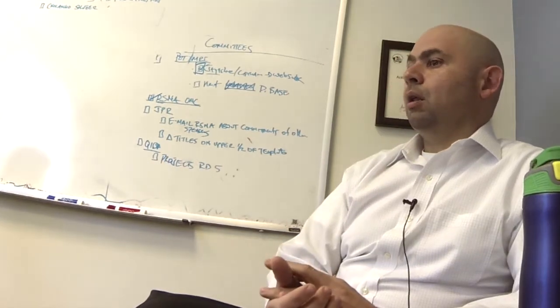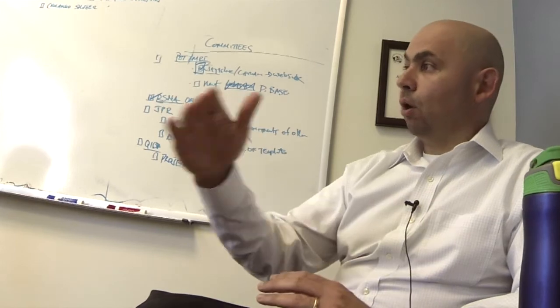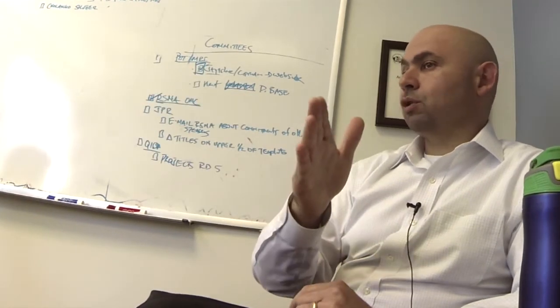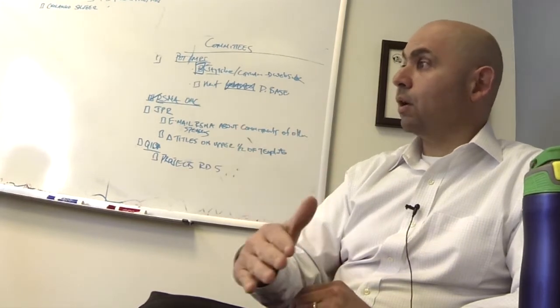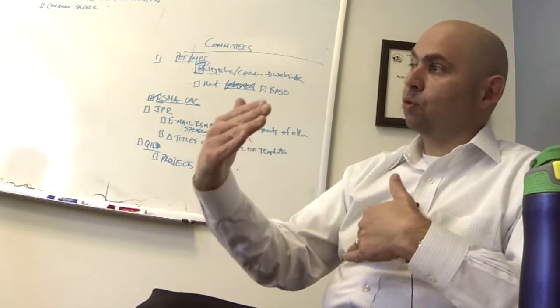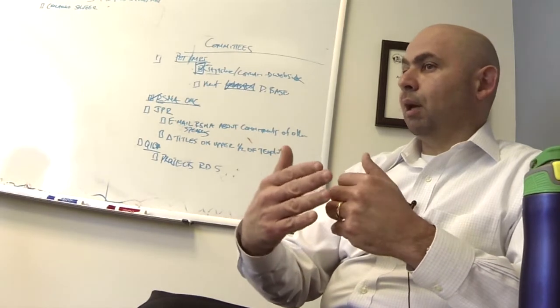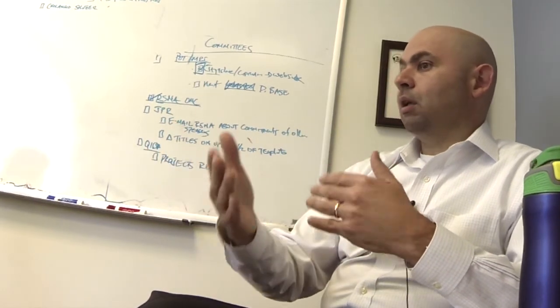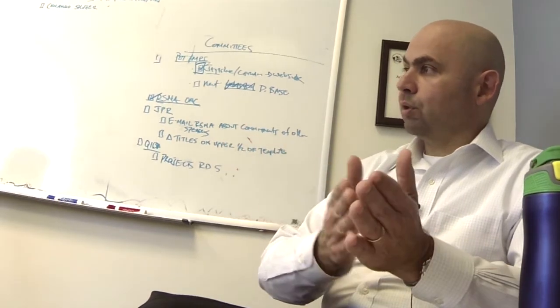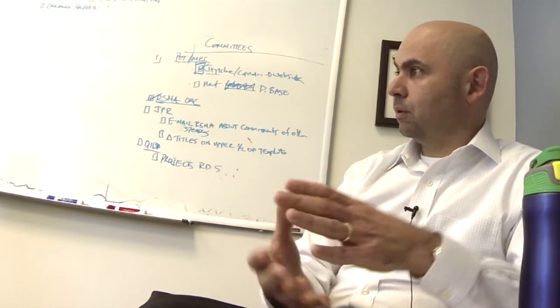On a T2 weighted image, things that have a long T2 would be bright because they would preserve signal, and things that have a short T2 would be dark because they've lost their signal. And therefore you're exploiting that contrast by weighting it heavily towards that contrast mechanism. Similarly, by varying the repetition rate, you can weight the T1, and therefore weight things that have short versus long T1s and make your image contrast based on that.